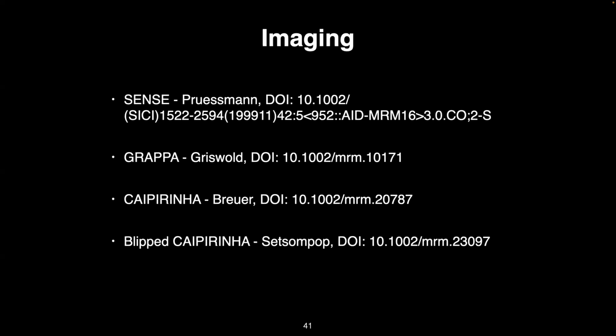What do I do? So the question was, if you're imaging in such a way with your gradients that you're pushing the limits, but your participants are feeling something, how do you handle that? How do you respond? As I've said, in the cases that I've done and experienced, there are no long-term effects. It is uncomfortable, so you do leave it to your participants whether they want to continue or not. Most protocols have language written in that should warn the subjects that they may feel these sensations.